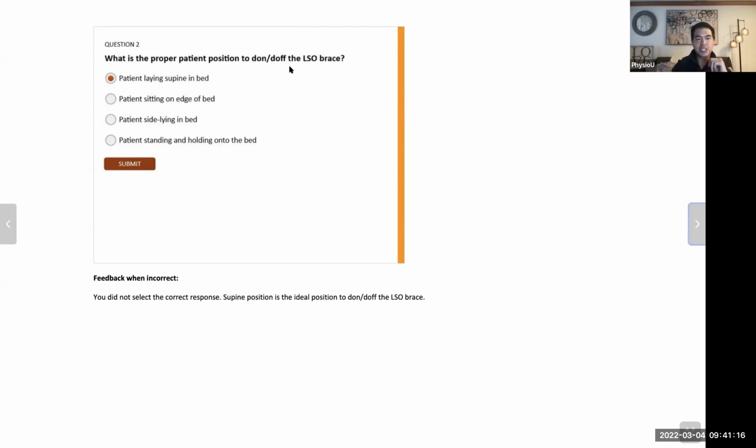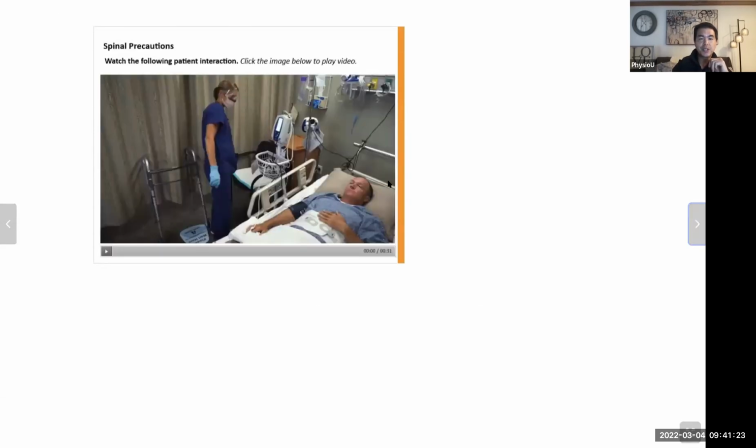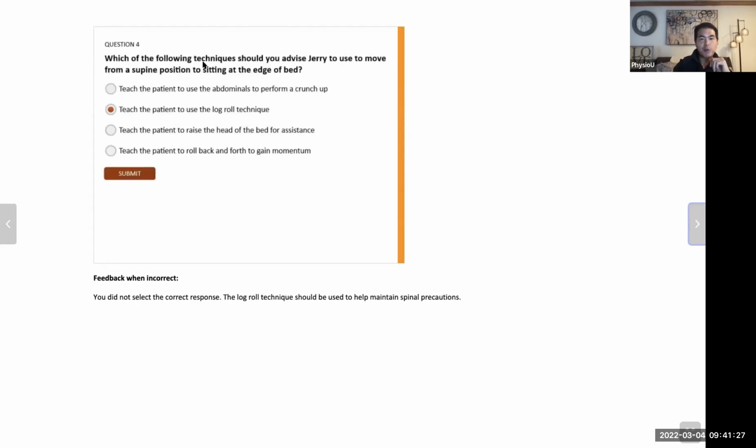So what is the proper position for donning and doffing the LSO brace? And you can essentially play through this entire game, watch a short video, and then have questions based on that video. So which of the following techniques should you advise Jerry to use to move from a supine position to sitting at the edge of bed? Teach the patient to use the log roll technique.